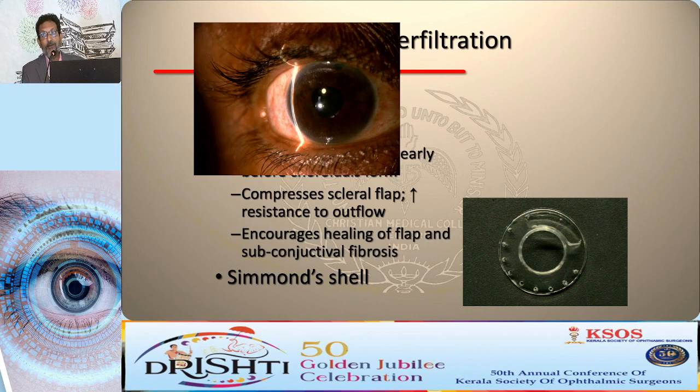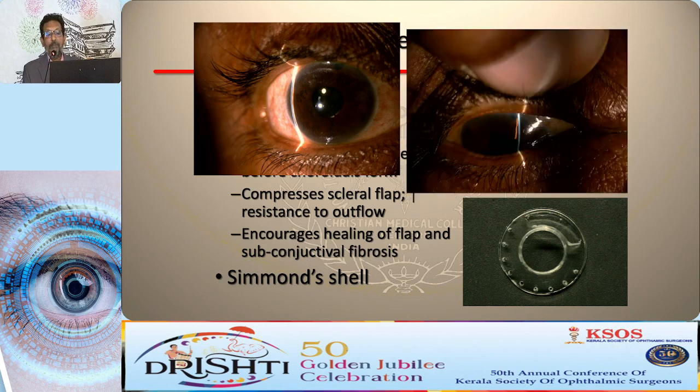One little trick that I have discovered clinically when trying to assess whether one of these conservative methods is going to work is, when you have a shallow chamber like that, you support the bleb with your thumb through the eyelid. And as you can see, the chamber has formed. It was much, much flatter earlier, and now with your thumb supporting it, it has formed. That means you've got a lot of aqueous being secreted. And the moment you stop the outflow of aqueous, the chamber spontaneously forms.